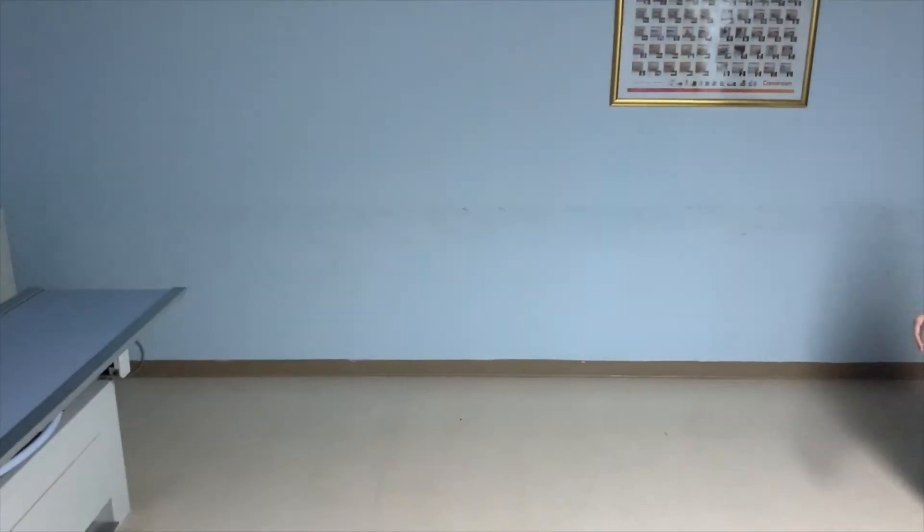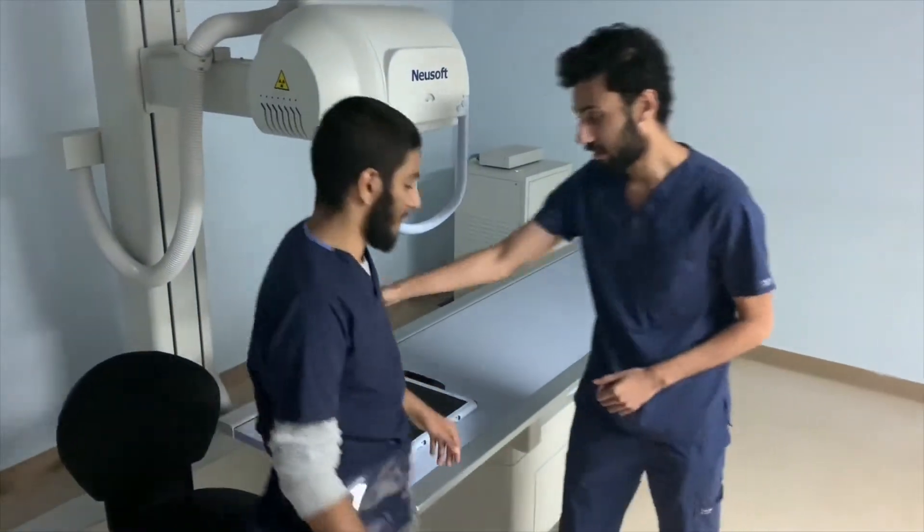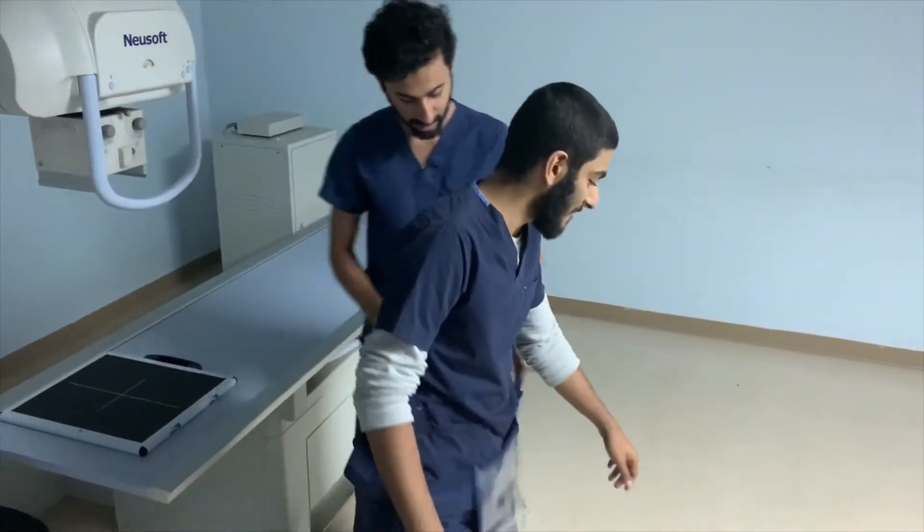After the exposure stage is over, the technologist is giving the patient a hand to take off the rather heavy half apron. Finally, he directs him towards the next healthcare provider.